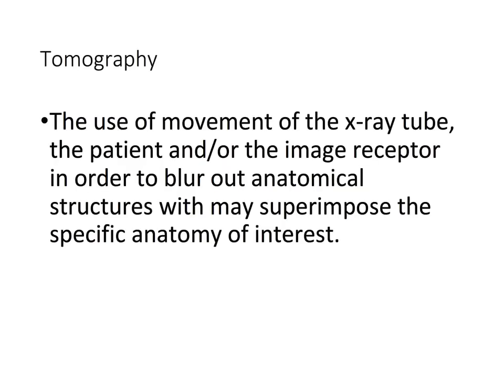Tomography is defined as the use of movement of the X-ray tube, the patient, and/or the image receptor in order to blur out anatomical structures which may superimpose the specific anatomy of interest. Typically, when we are referring to tomography, we are referring to when the tube and the image receptor are moving, and the patient or body part are still.